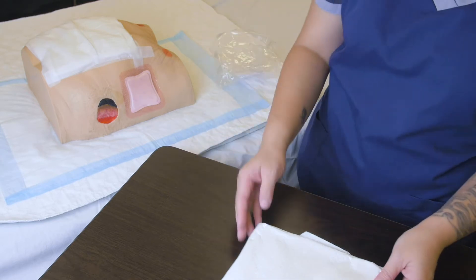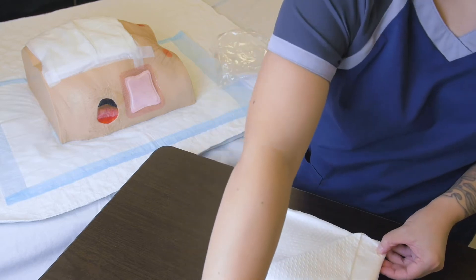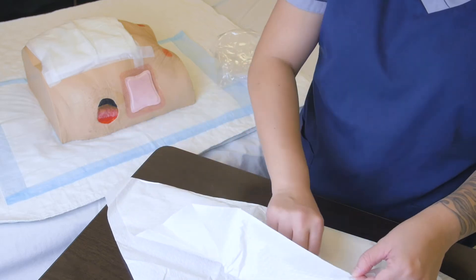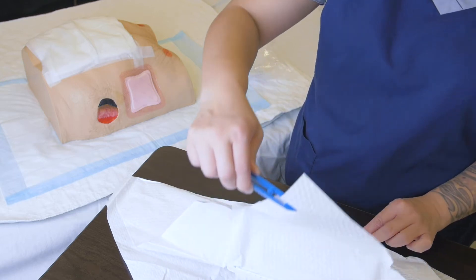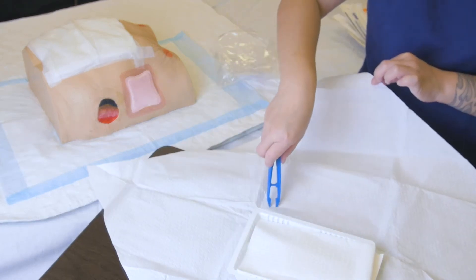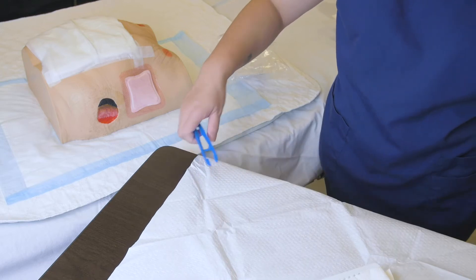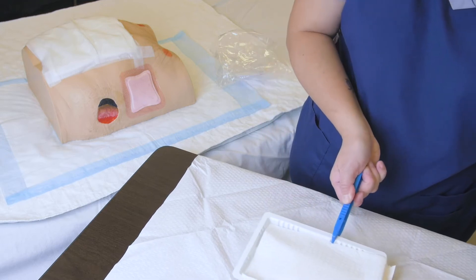We always want to open the first flap away from us — that prevents overreaching later on when we open the fourth flap. Here we are exposing the forceps hidden underneath the fourth flap. We carefully loosen up that edge and let our fingers take over. Then we choose our orientation; today we're going to set it up in a square format, rearranging everything accordingly, and we can move the tray closer to where we need it.